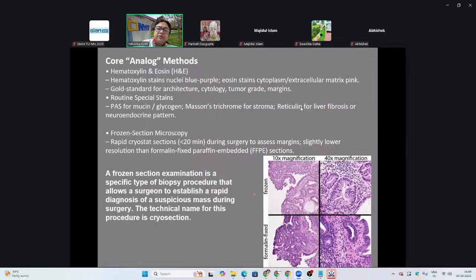So now we go to the part where we discuss some of the basic methods and some of the different kinds of methods of imaging, what the method of staining is, and of course how to get different imaging. So the H&E stain, we talked about this before. That's really your gold standard, and it is that blue and that purple.